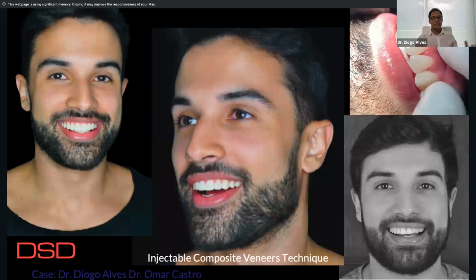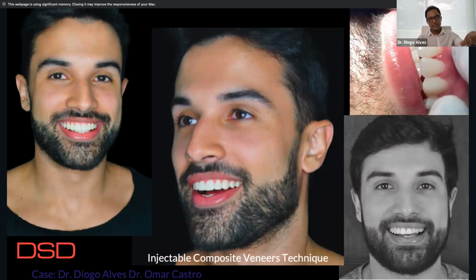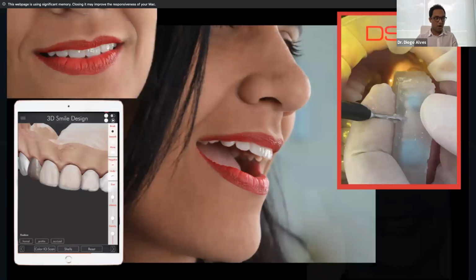And then that is the final result the day after. Very simple, and you guys can see on the video on the right side that I did not touch the buccal surface. I just did polishing and finishing, and the natural morphology was there, and that was something that I did not touch on. Of course, some adjustments in the buccal, in the incisal edges here and there, that is totally normal, but the major work was done with my designing on 3D and with the technique itself.